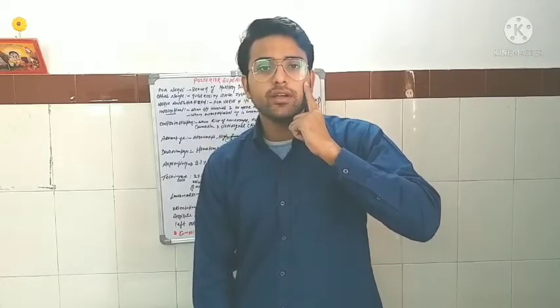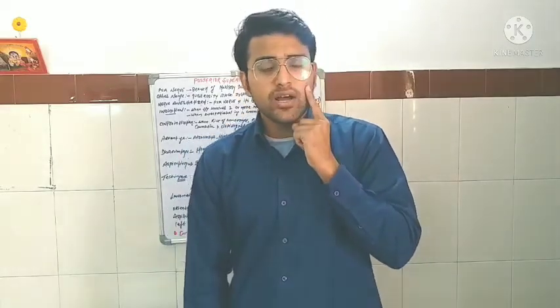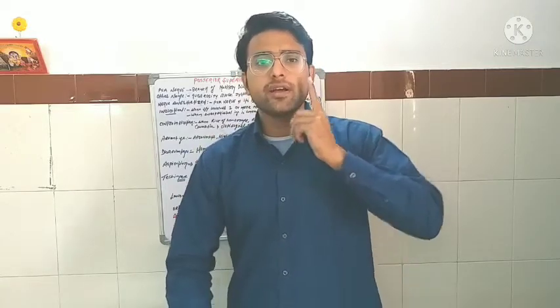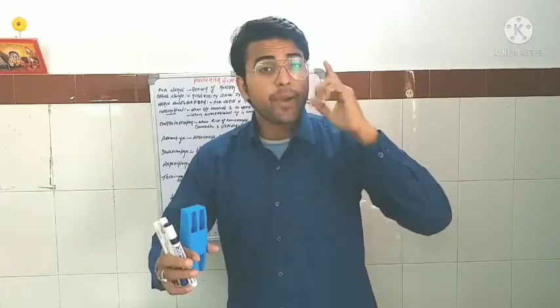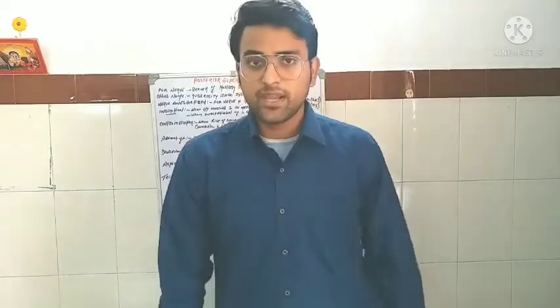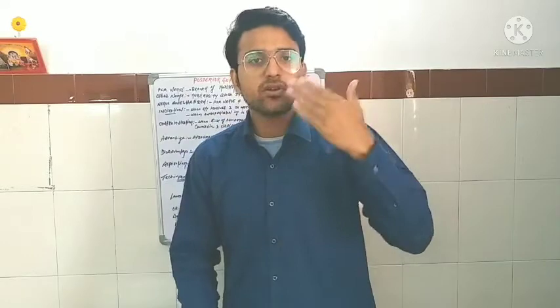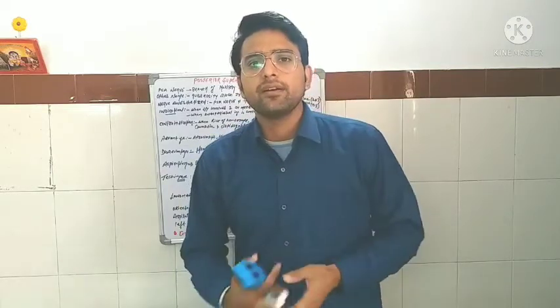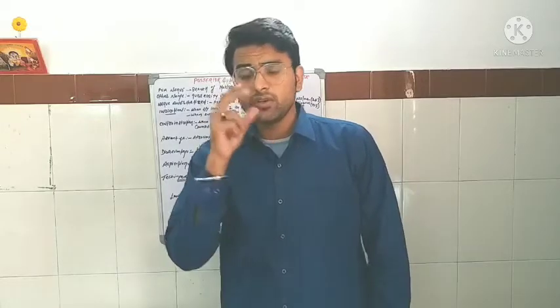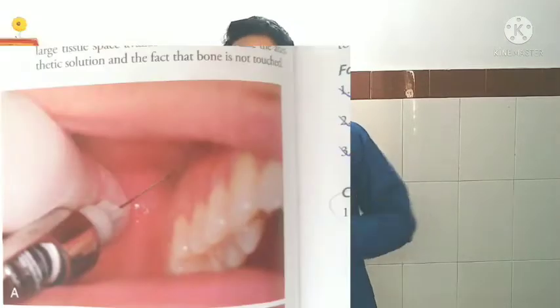Then rotate the finger, keeping the bulbous portion of your finger on the zygomatic process of the maxilla, and lower down your finger such that, as Monheim tells, it is perpendicular to the occlusal plane of the maxilla. Then make an angle of 45 degrees. Your index finger will point out the direction of the needle to be inserted. Then retract the cheek, and penetrating the buccinator, you will find that your needle is inserted in the right direction. And now insert the needle in a pen grasp method.